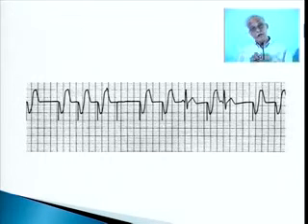Looking at that and the rate, you can make out that this patient has a pacemaker and it is functioning properly, or if there is any problem, then you can, of course, refer to a senior cardiologist, so they can do whatever is needed. I think that is in brief about pacing. For a postgraduate to begin with, this is good enough.